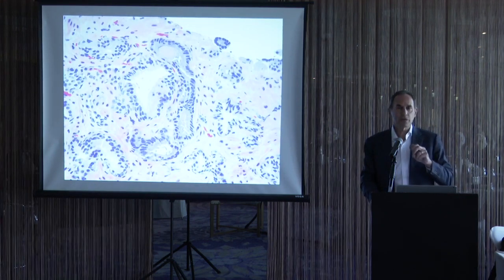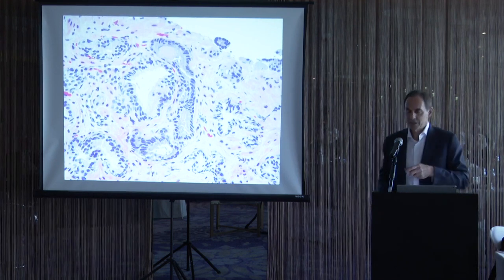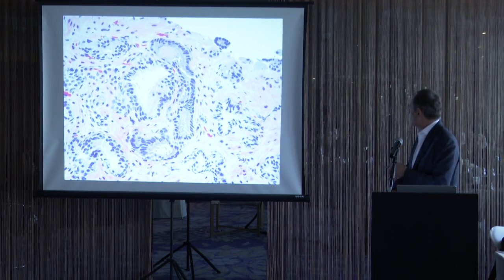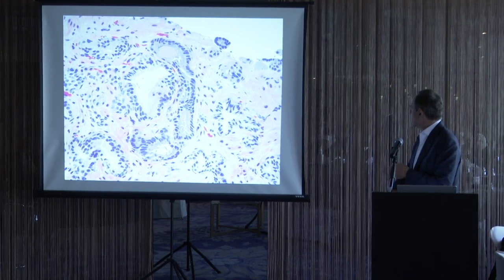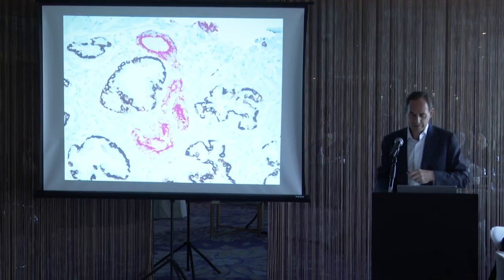The times that I'm most comfortable diagnosing cancer on just a few malignant or atypical glands is this situation, where I have a benign gland, another benign gland around it, and then an atypical gland that's tightly packed in between here. This gland has amphophilic cytoplasm, some enlarged nuclei, dense pink secretion. There's nothing benign or even precursor premalignant lesion that would have this appearance. High-grade PIN would not be a gland tightly tucked in between a benign gland. High-grade PIN is pre-existing benign glands with atypical cells. So seeing this gland tightly in here, basically that can only be cancer.